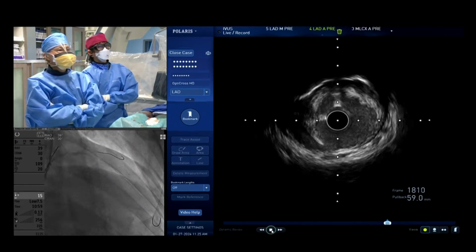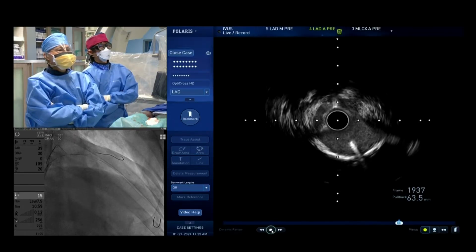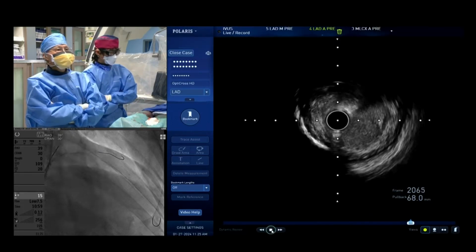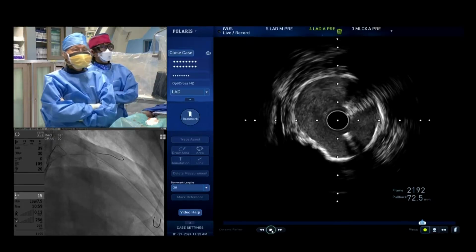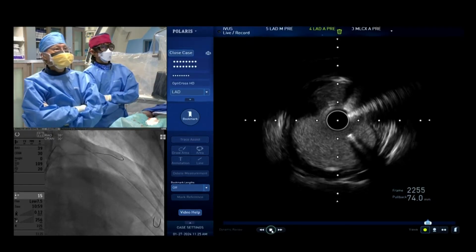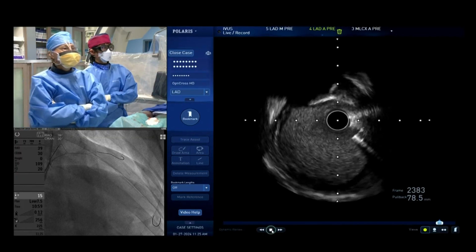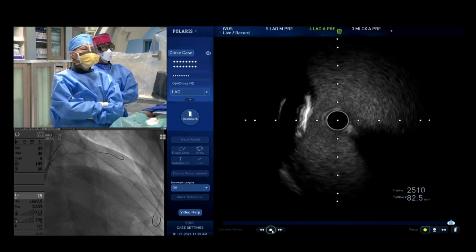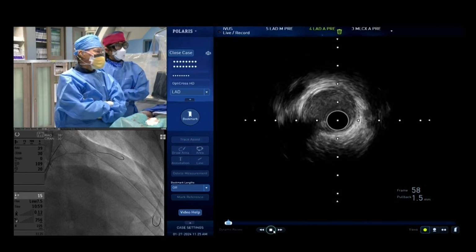I've never been terribly confident for left main DCBs, no matter what IVUS and angio show. But I think in this case you have illustrated very well the power of intravascular imaging to be able to delineate the underlying anatomy and hopefully guide whether we can use the DCB. But I'm going to ask Hee Hua, you are a well-known expert in using DCBs. Would you, having seen this particular IVUS, put in a DCB or?